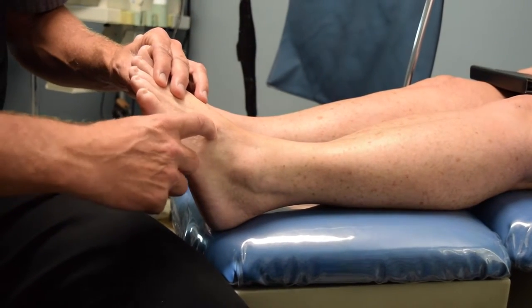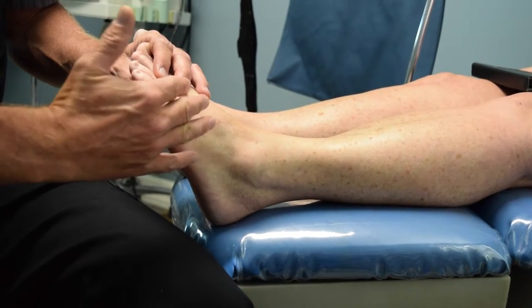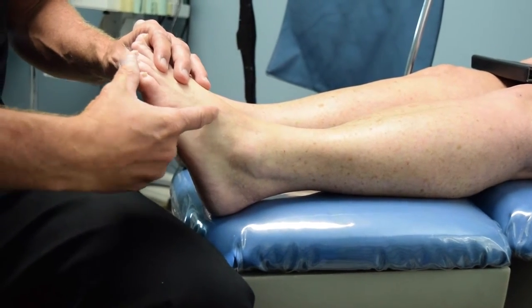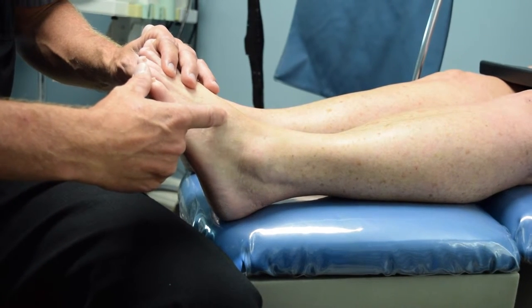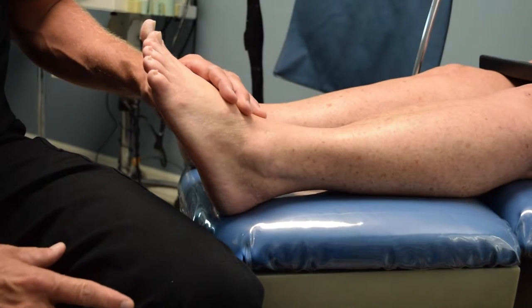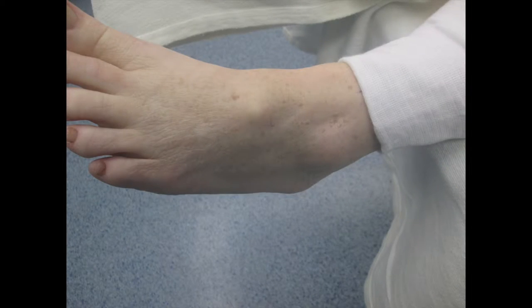To correct the exostosis on the dorsal aspect of her foot, we made a small incision and used instrumentation from minimally invasive surgery to free down to the periosteal layer, thereby taking vascular structures out of the way dorsally. We then used a 3-1 burr and also an Isham straight burr to remove the exostosis. I'll show you and discuss the surgical procedure now.